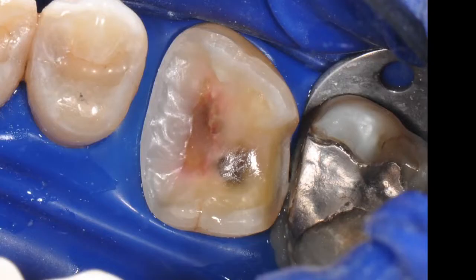All dentin surfaces, including the residual decayed dentin, were sealed with bonding agent and covered over with a thin layer of flowable composite. This step is referred to as immediate dentin sealing and is performed to create an established hybrid layer for an ideal bonding surface for the composite onlay.